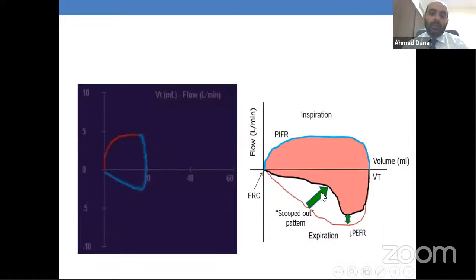Again, you see it in the flow volume loop. So go in without problem, then we will go out, there is resistance. So it should go in this way. But because of the resistance, the air is coming very slow. So as we said, this looks like the pulmonary function test. So this can be due to secretions, as we said.